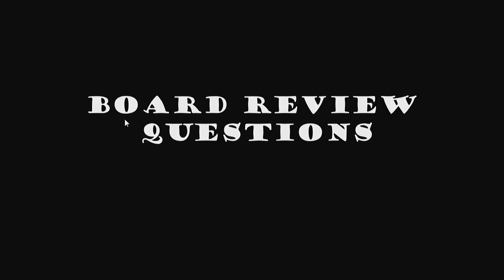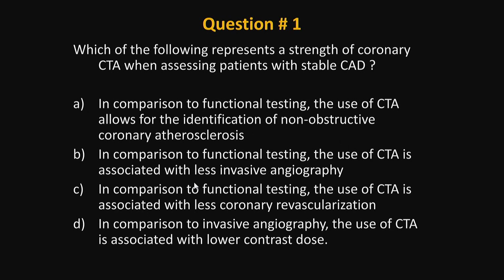Let's now do 3 board review questions. I will first show you the question and we will then discuss the answer. Question number 1. Which of the following represents a strength of coronary CTA when assessing patients with stable CAD?